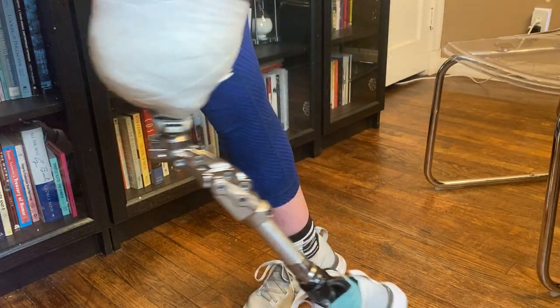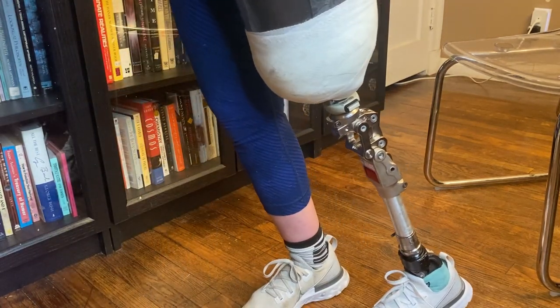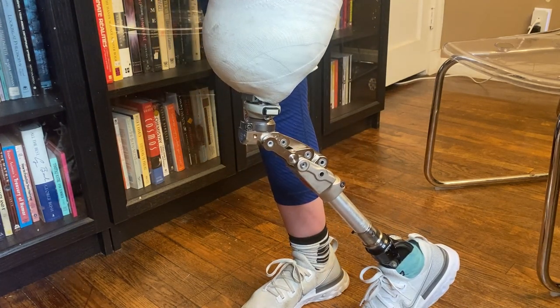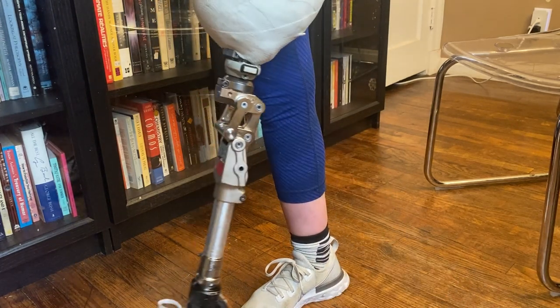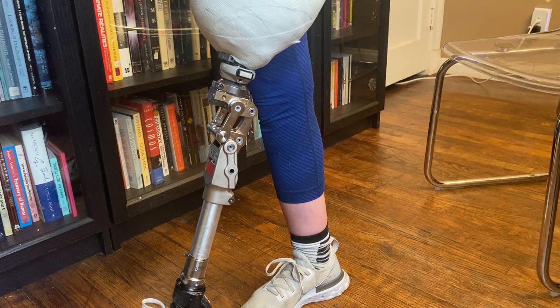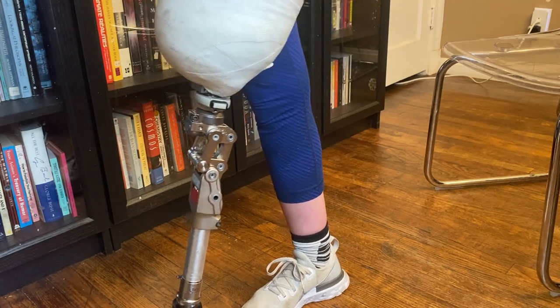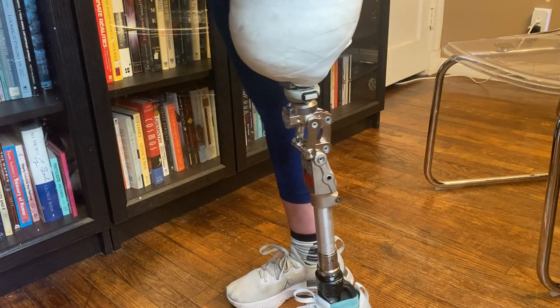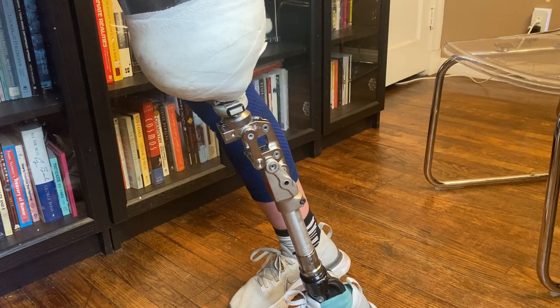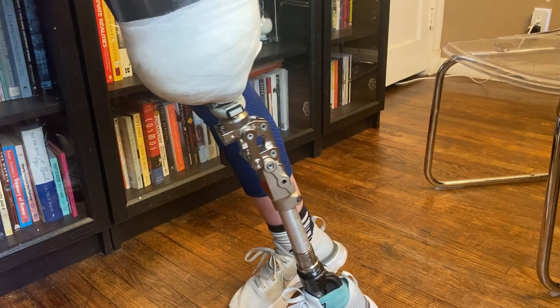And then of course, when I extend my leg, it goes back into place. So once I flex at the hip and take weight off of it so that it's not touching the ground, then the extension assist, which is hydraulic, extends the leg back into place, and then you put your heel back down. So it cannot bend when you're in heel strike or standing level on the foot — it will only bend when you put your weight on the toe of the foot.